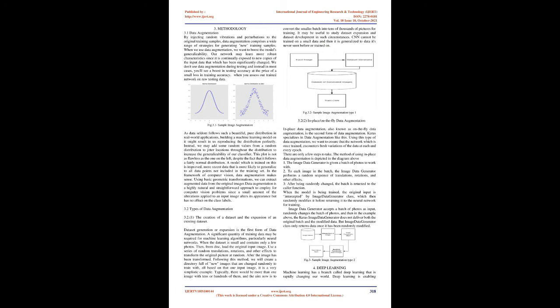To identify CT scan pictures based on their attributes, we created a CNN model. This will shorten the time it takes to diagnose COVID-19. With an accuracy of 90%, a chest X-ray may correctly identify patients.